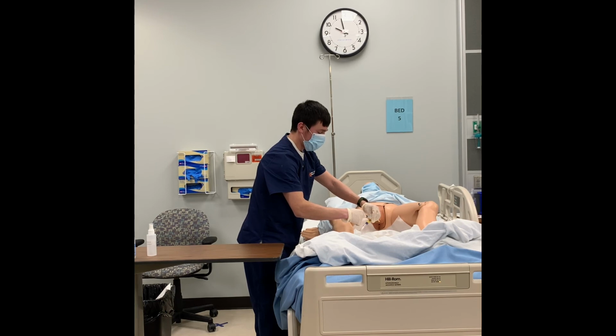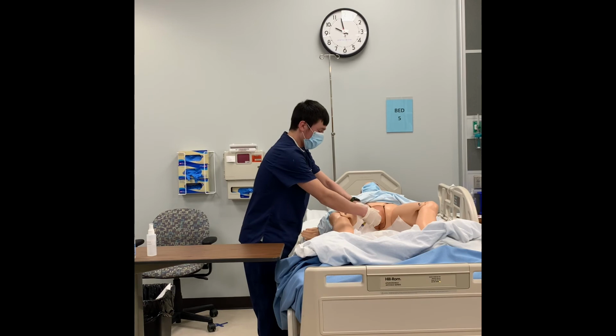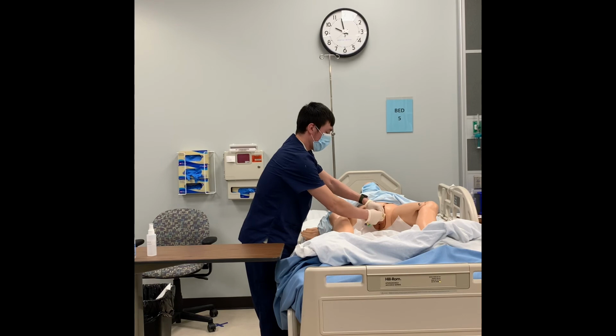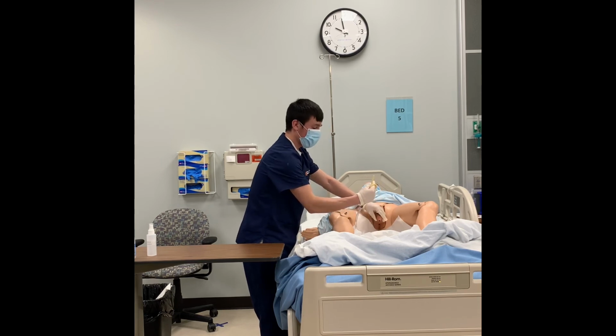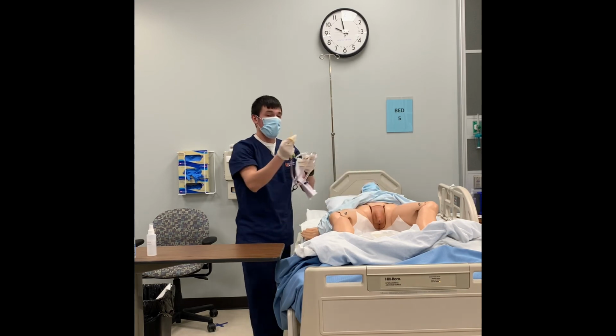Before I would start to remove, I would make sure that the bag is empty, just in case I need to remove any of the urine that may be in the bag. There was no urine in the bag, so now I would go ahead and have the patient cough or take a deep breath. As he does that, I would remove this nice and easy and make sure that this isn't flipping around. From there, we would take the bag and discard it in a biohazard bag.